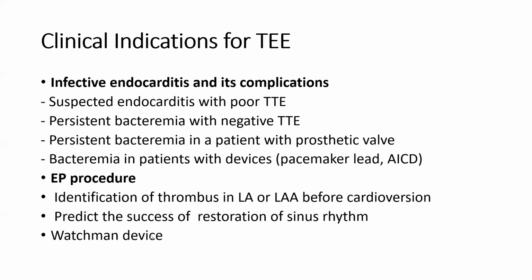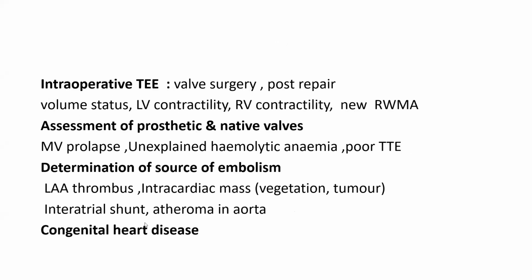For the Watchman device, you have to do a full comprehensive study of the left atrium, sizing the left atrium in different views. We will give you views on that. Intraoperative, of course, post repair, post mechanical valve.